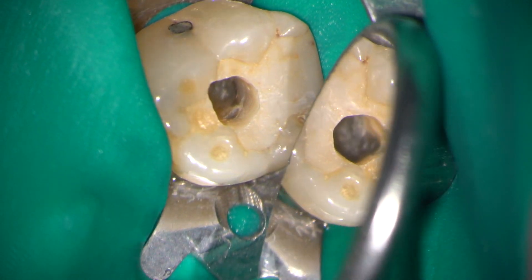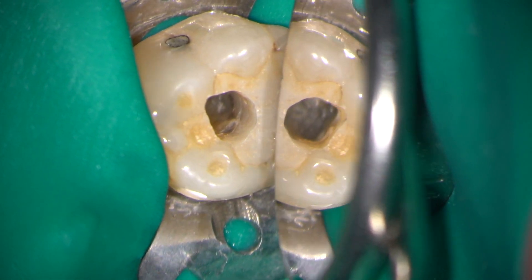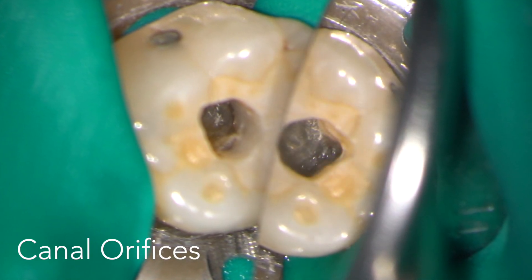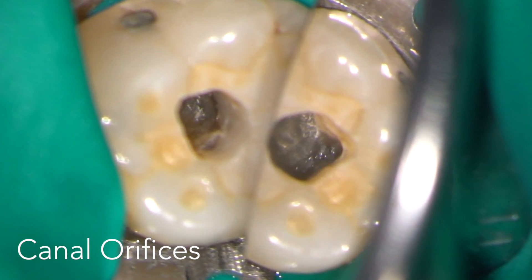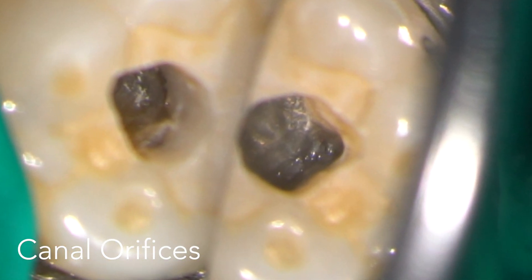We're now looking into the access cavity under high magnification microscopy. We can see the mesial canal orifices reflected in the mirror, and the distal canal orifices with direct vision.